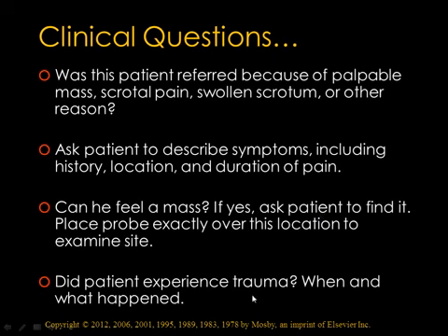Again, ask the patient if he had trauma, when and what happened. This information is necessary not only for guiding the examination but also for interpretation.